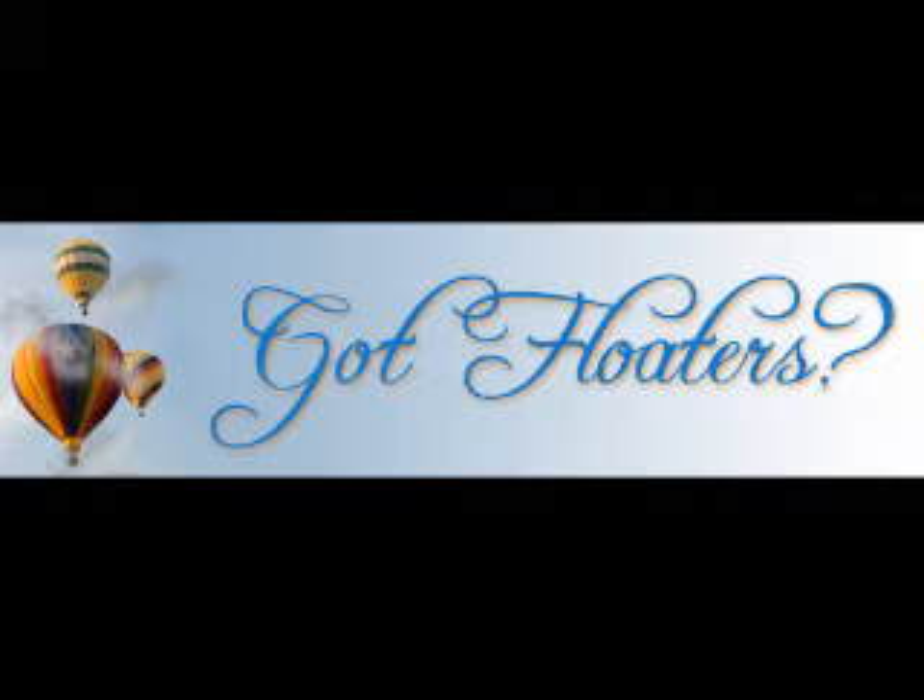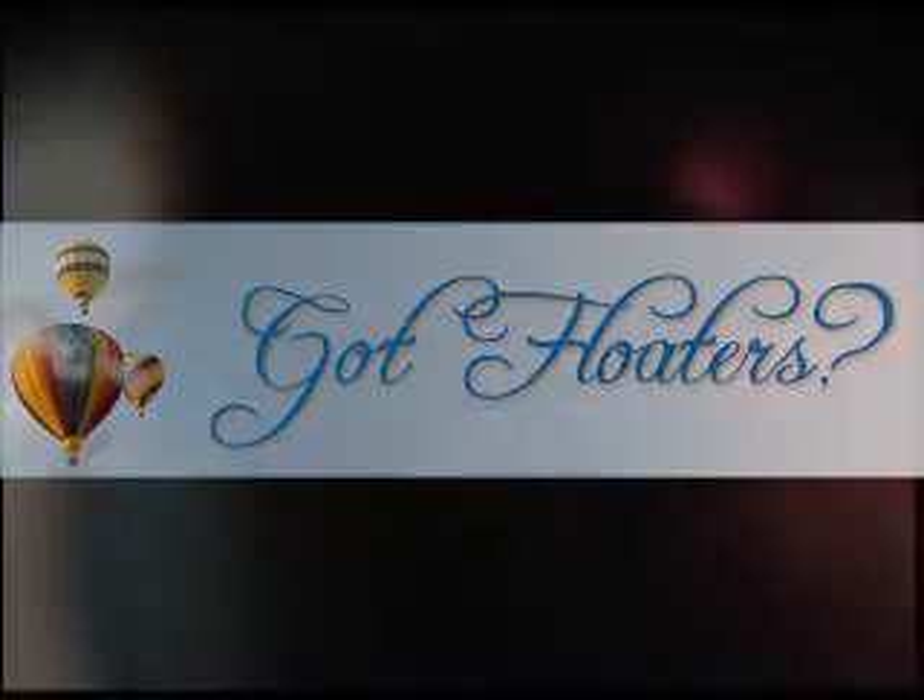This is Dr. James Johnson of the Orange Coast Laser Vision Center, where we specialize in the non-invasive use of the laser to treat vitreous floaters. I've been asked by a few people to see more of these videos that are my view through the laser treating these vitreous floaters.